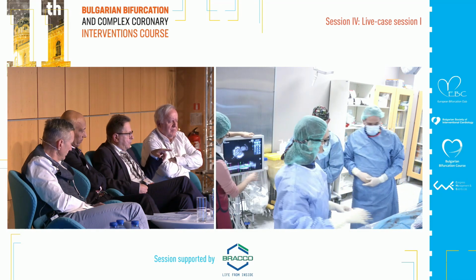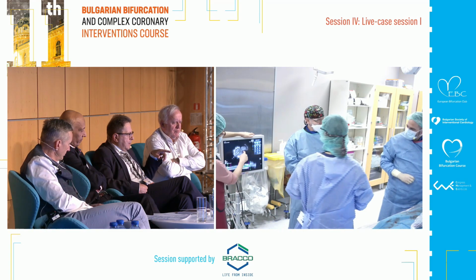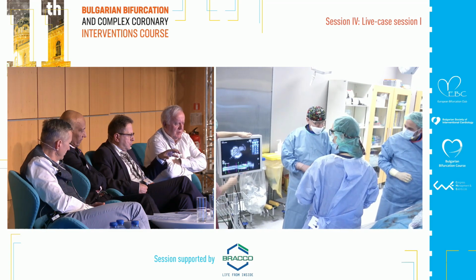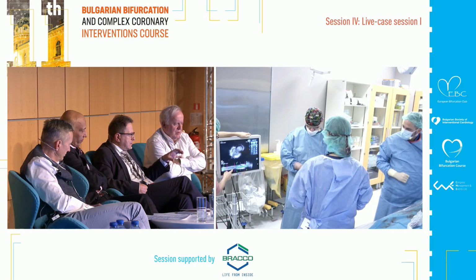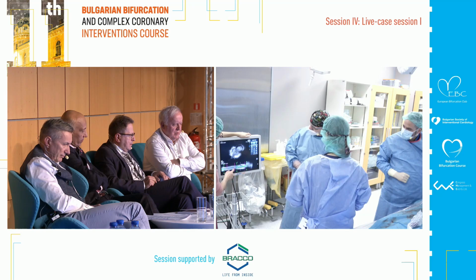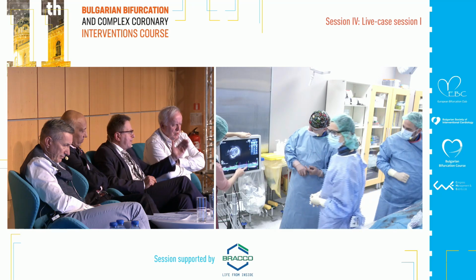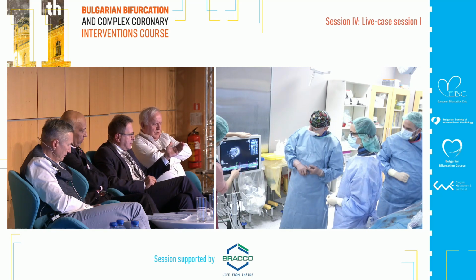But look, you have three wires, I mean, what do you propose? Could you give me a closer view? Just go back a little bit, go back distally. From distal to proximal, you will see that the plaque from 12 to 3 o'clock is coming.